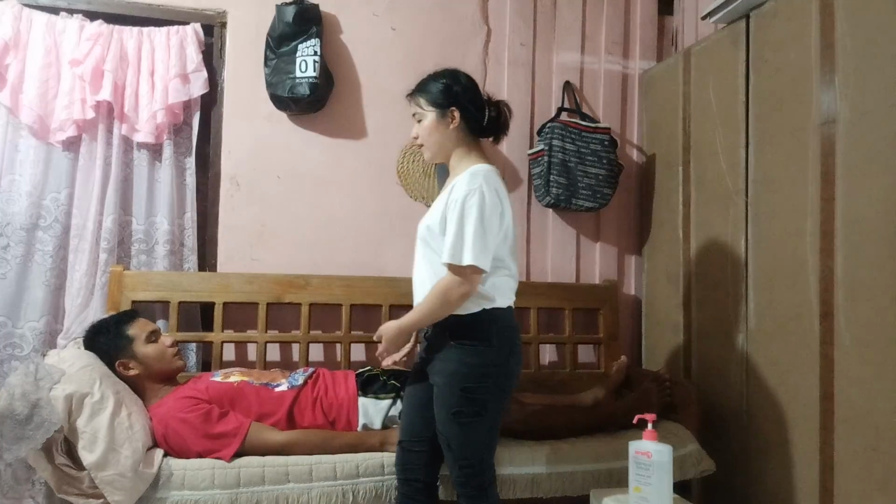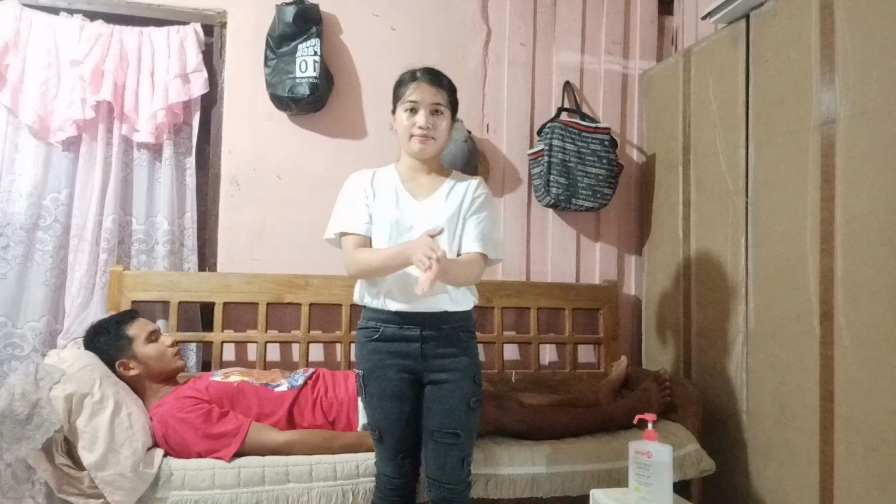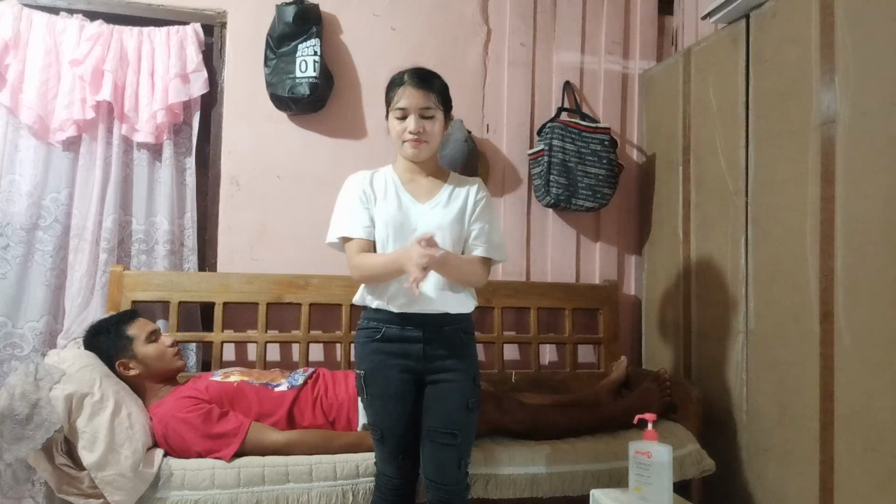So, the next step that we have to do after ensuring that our client is comfortable with his new position, we can now proceed to performing hand hygiene, in which I will use this alcohol-based hand rub. And that's the end of the procedures on moving a client up in bed. So thank you very much for watching.